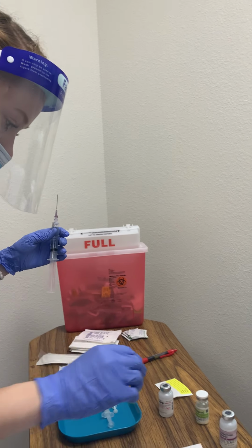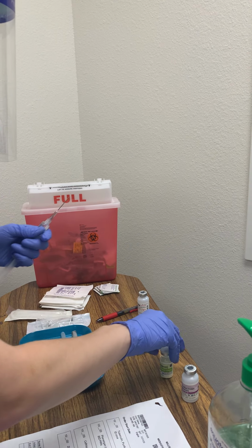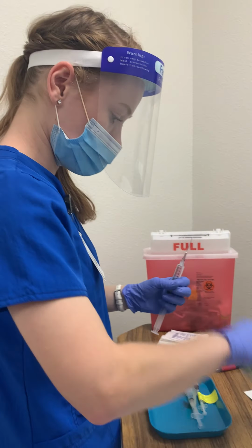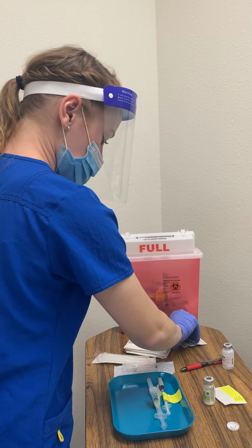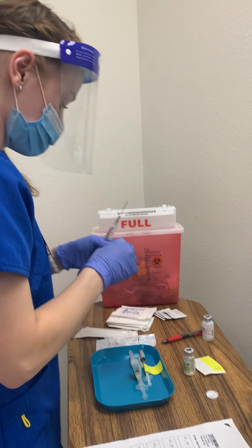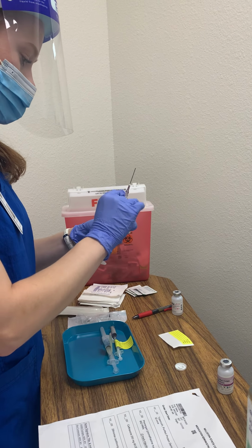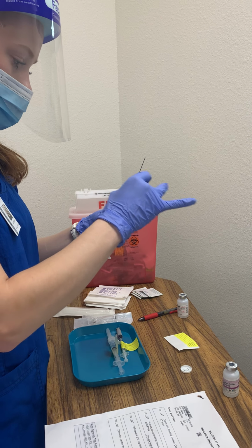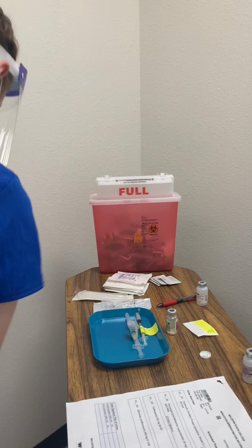So once I've gotten that, sorry, it's taking me so long, I can put my sterile water aside. And I'm gonna open this up. And then I should have done this beforehand, but I'll wipe this for 10 to 15 seconds. I would have recapped my needle, but I threw the top away, so let it dry. Throw that away.